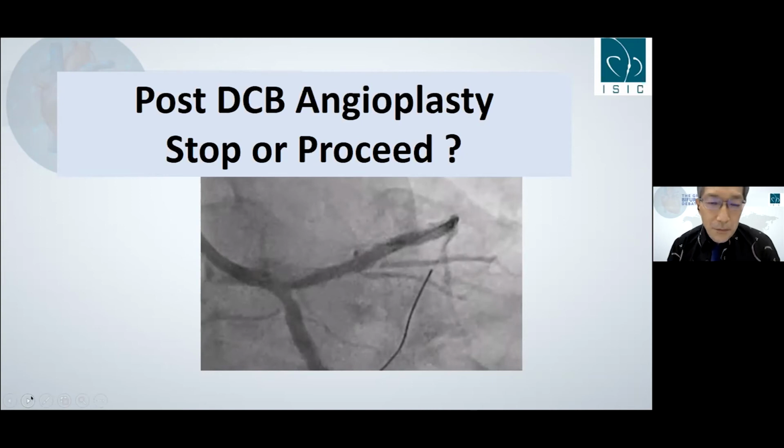Thank you for your nice case. Actually, I completely agree with Dr. Murasato. I want to know what happened in this part, just the proximal LAD. Why did this stenosis occur? I really want to know if the stent still shows underexpansion. At that time, we have to dilate more and more with high pressure.